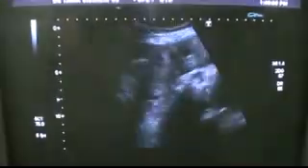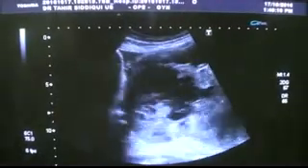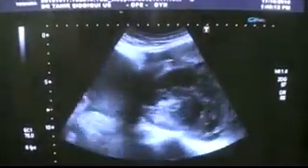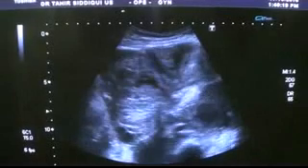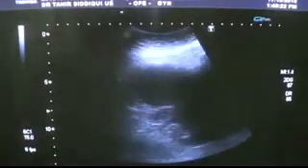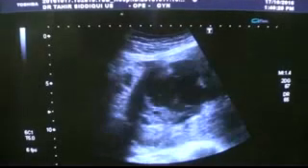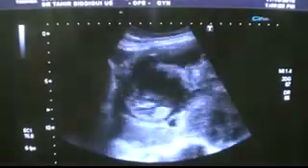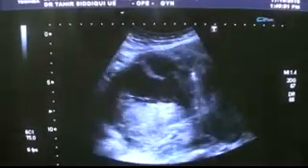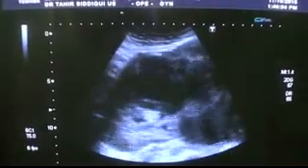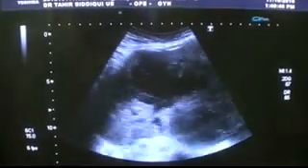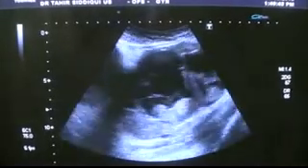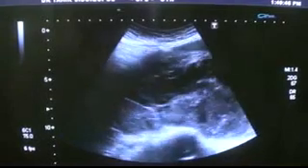It expands on both sides. Now I am on the left side of the pelvic cavity, maintaining its complex appearance. Now I am on the right side. It is seen all over the lower abdomen up to the umbilicus in the midline, extending on both sides. You can also see the calcifications and septars.